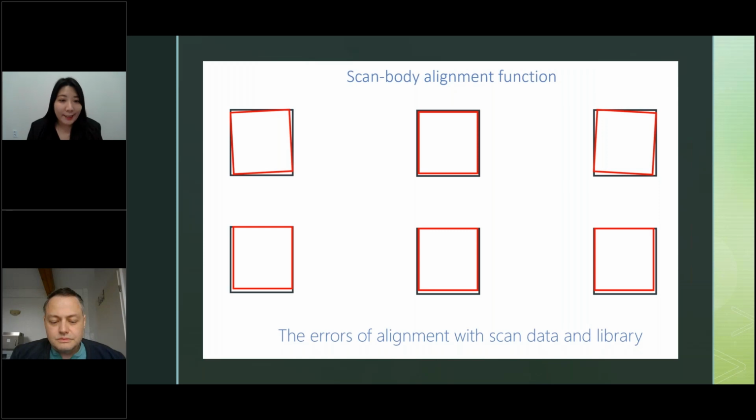My understanding is that once I make green the area where the distinctive shape is on the reliability map, I can stop scanning even though there's an empty area on the back side of the scan body. Is that correct? So let's think about the scan body. The scan body has parts that are scannable, and these parts that are scannable are usually built of a flat surface, of a top plane, and of a cylinder.